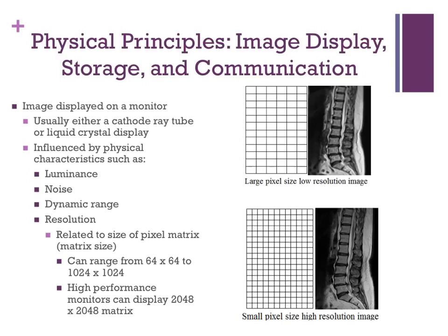The display matrix can range from 64 by 64 to 1024 by 1024. High performance monitors can actually display a 2048 by 2048 matrix.